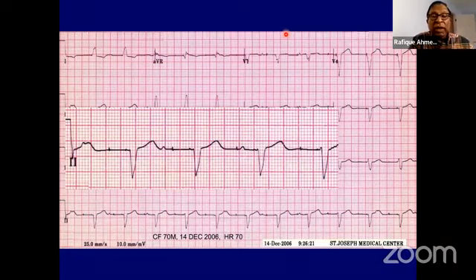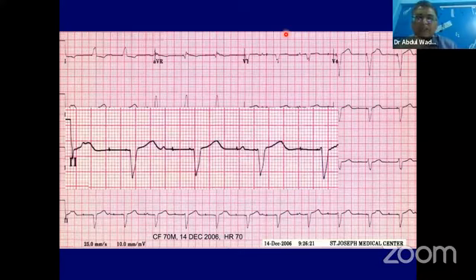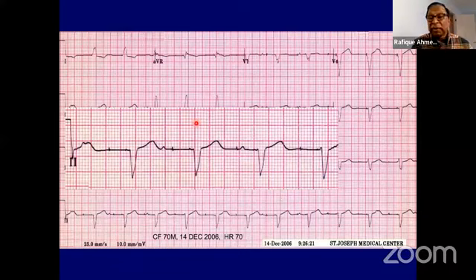Number two, let's say a 70-year-old comes to me totally asymptomatic, and the pacemaker has 2 years of battery left. What I may do, I will tell the patient, look, I know the atrial lead is not functioning, the ventricular lead is working, you are doing well. Let's wait until the battery runs out. And at that time, I'm going to put in a new atrial lead. So that's an option. And the third will be, you can make a clinical decision after discussion with the patient. Look, just leave it VVI, and the patient will do fine. Lead to extended life. Yes, exactly. But at that point, I'm going to program it VVI instead of DDD, because then it is going to waste battery for nothing.